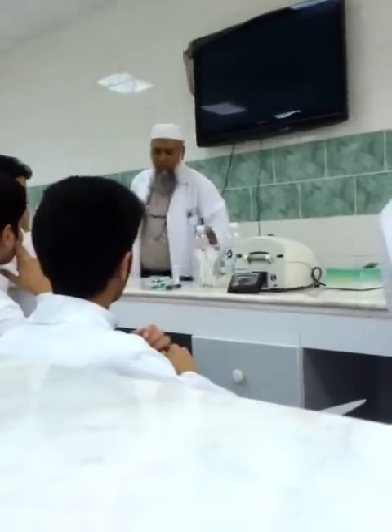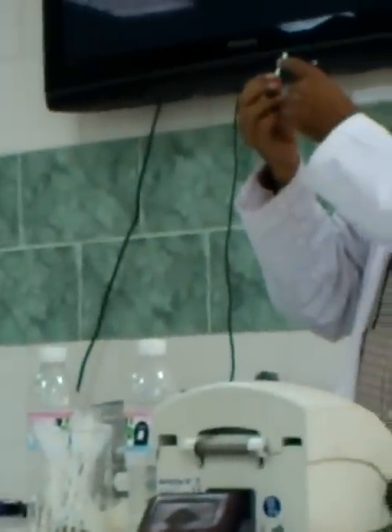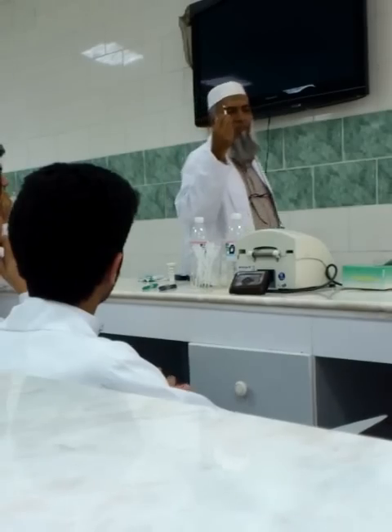The second thing is that when you are putting the drop of blood here on the colored area, what is the use of this circular yellow area on the back side? What is its use?